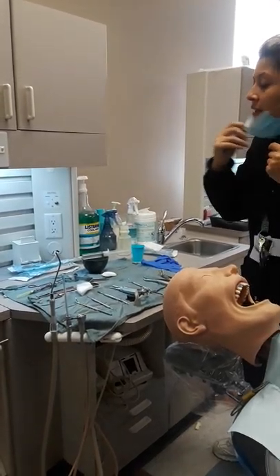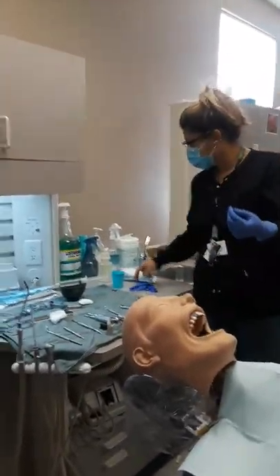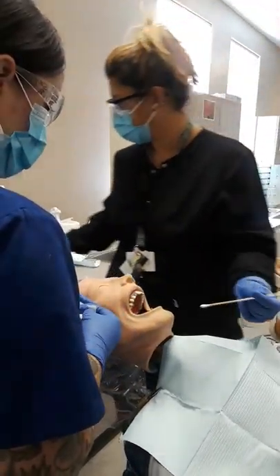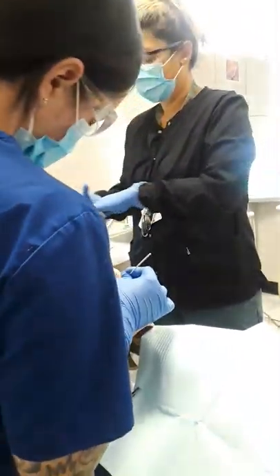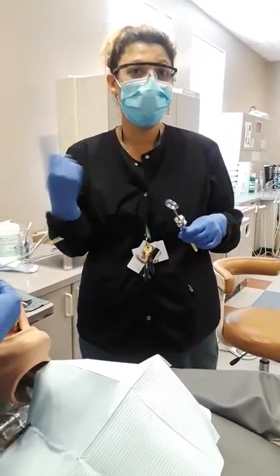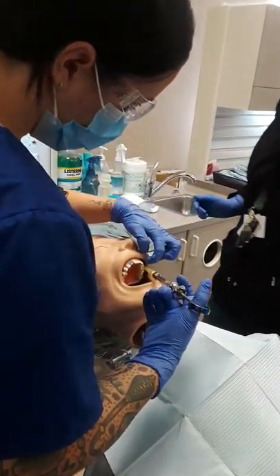My doctor's gloved up, I'm going to glove up. Mask, glasses, gloves is the order. First thing we're going to do is wipe the gum tissue, get rid of the saliva, and put topical gel. Quick rule of thumb: always make sure that your harpoon is engaged before you pass it to the doctor. That was one of the worst things to get yelled at about — he'll have to poke the patient twice if it didn't work. So pass that, expose your needle, put your cap down for your doctor to recap as she anesthetizes.